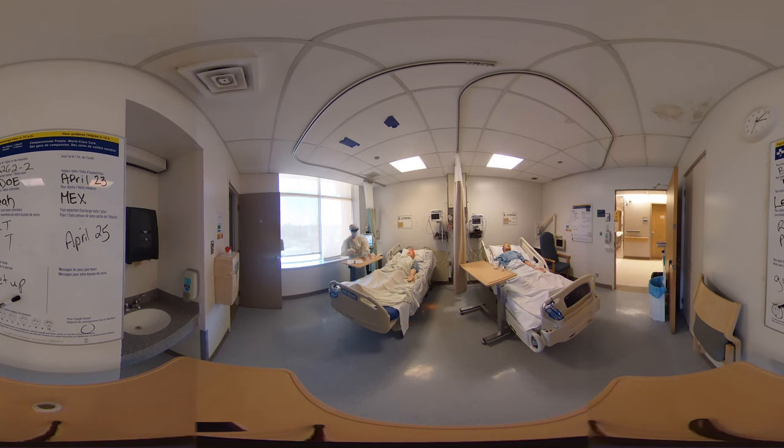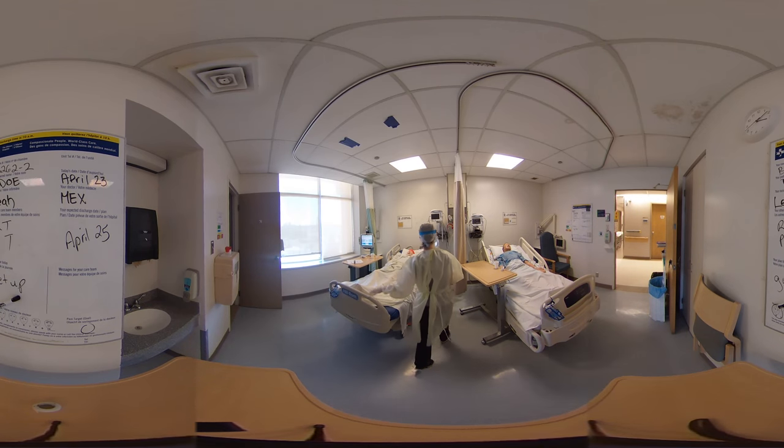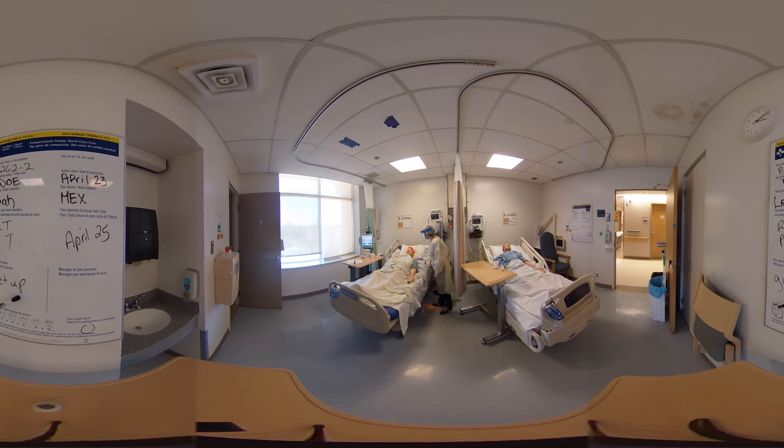Now I'm just going to do your vital signs quickly, if you don't mind. I'll put that on your finger. I'll just scan your bracelet quickly. So I notice your oxygen is a little bit low — it's about 88%. So what I'm going to do right now is bring your head up a little bit so it's easier for you to breathe, and I'm going to turn your oxygen up. You're sitting at 3 liters right now; I'm just going to turn it up to 4 and see if that might help.